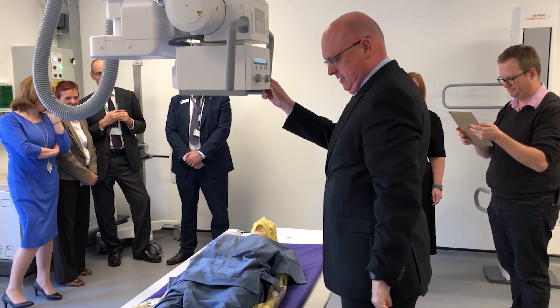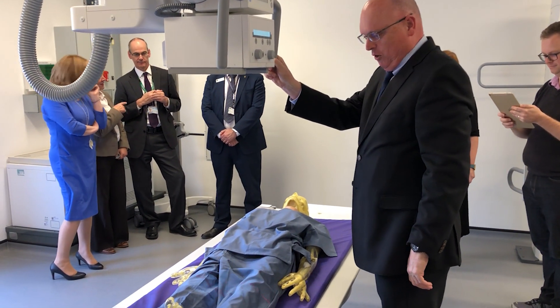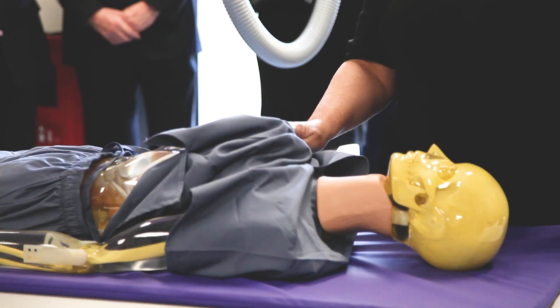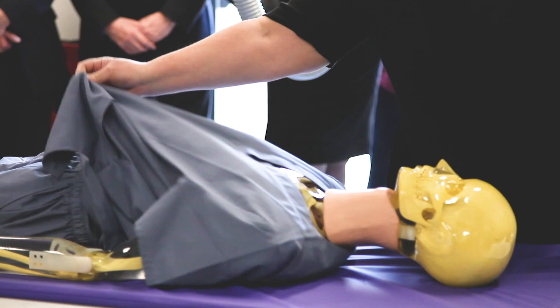This is a Siemens fully digital machine which we're going to be using for teaching the students. As you can see, we have a Pixie phantom which pulls apart. She's tissue equivalent, so it's like taking a picture of a human being.